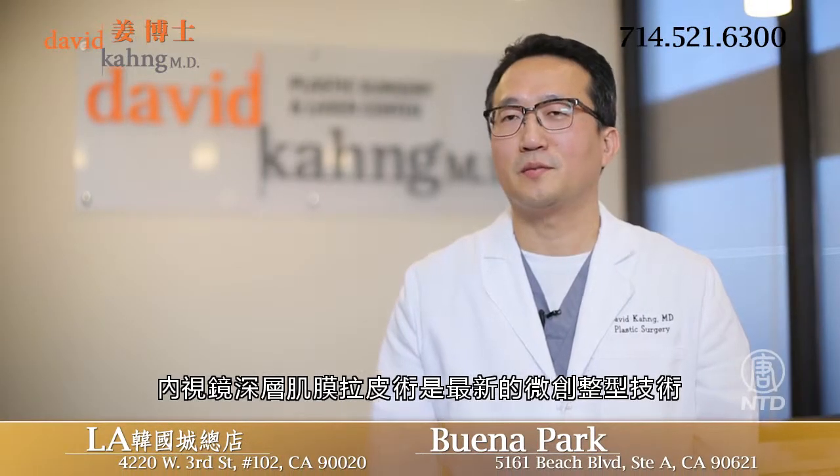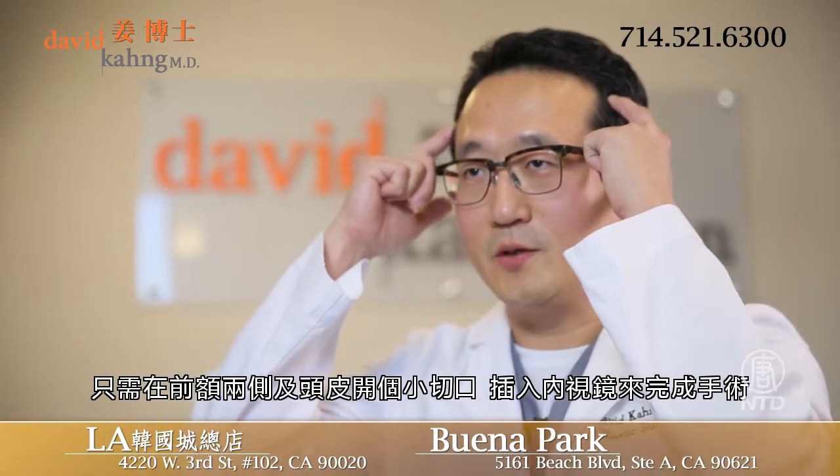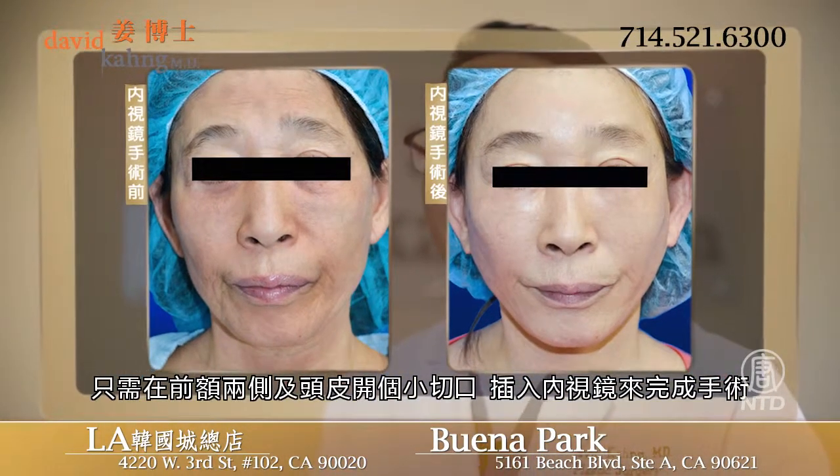Endoscopic brow lift is the latest minimally invasive technique to rejuvenate the upper third of the face. Small incisions are made, two in the temporal region and three in the scalp, to insert the endoscope and to perform the procedure.